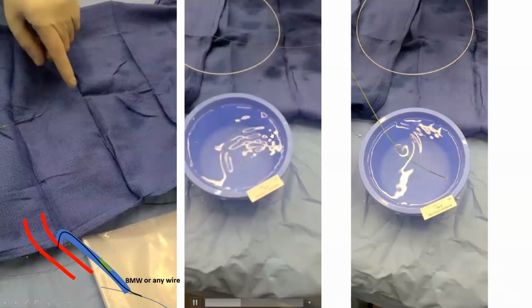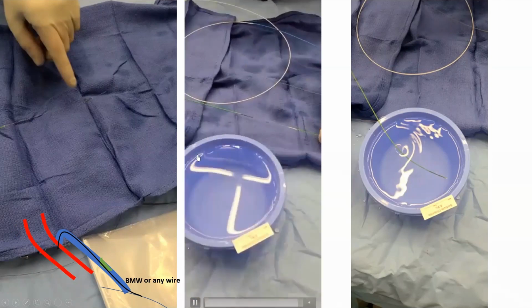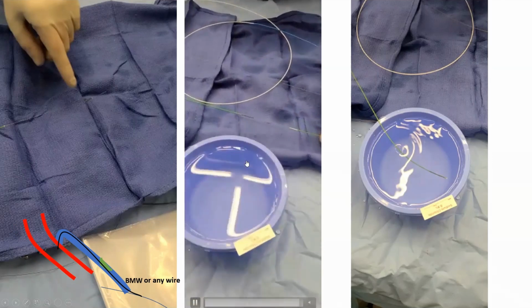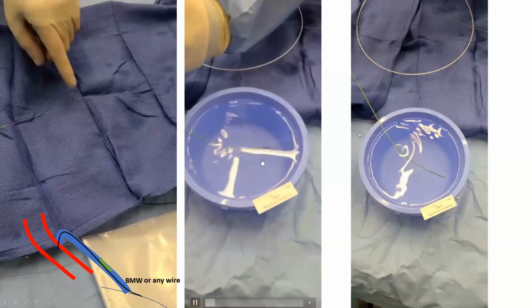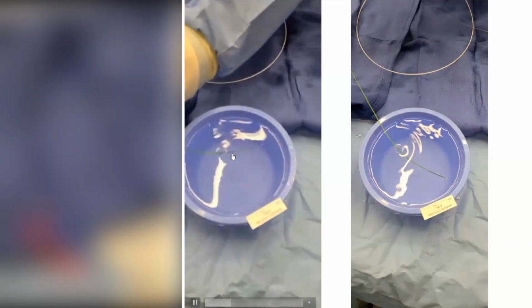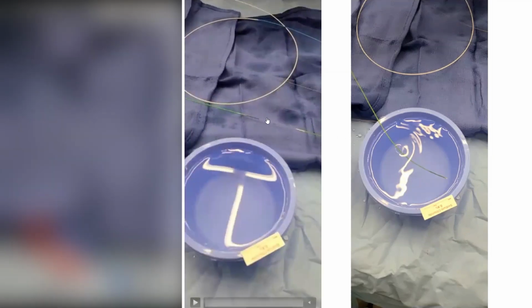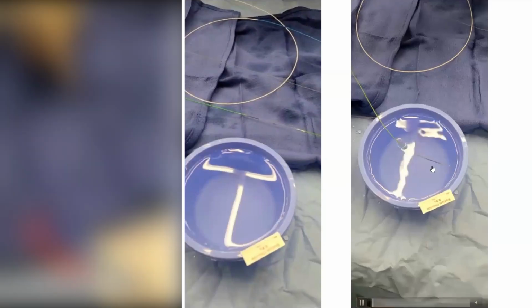Afterward, you put the spider wire basket in a bowl of saline, and you pull that wire into the green catheter. You try to squeeze the air bubbles out. That's the point of that. And you may do it a couple of times to squeeze the air bubbles out. And we station that basket in the transparent portion within the green catheter, behind a white area. Look at it again.